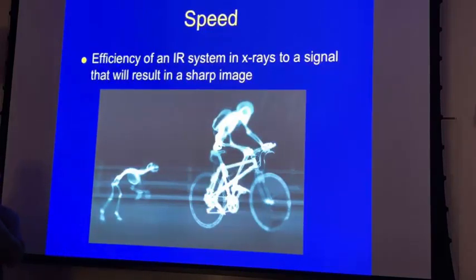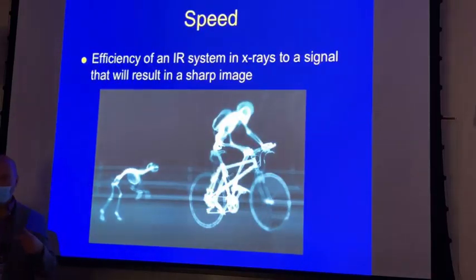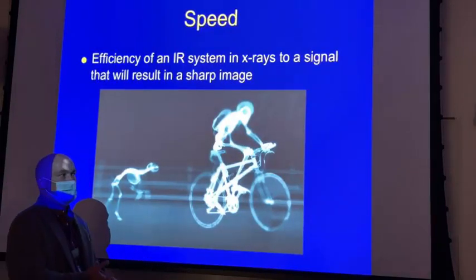So it's all about radiation dose reduction. Remember that the introduction of double emulsion film and intensifying screens was nothing but cutting back radiation exposure to the patient.